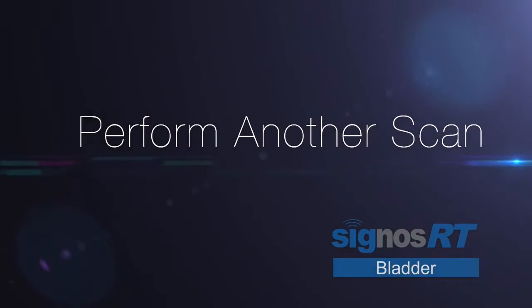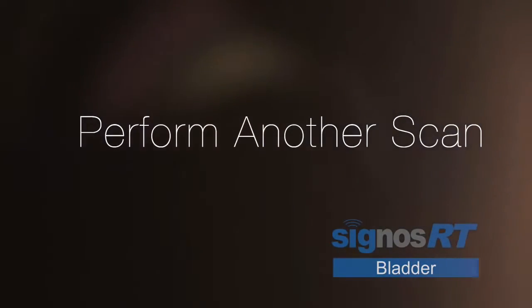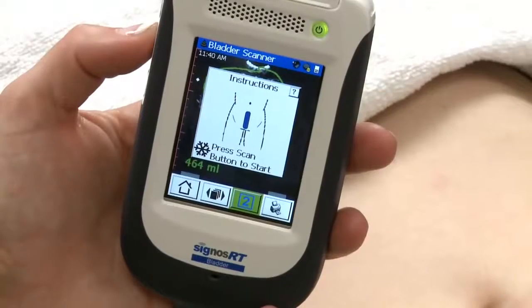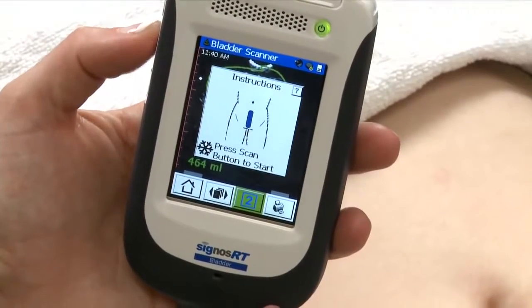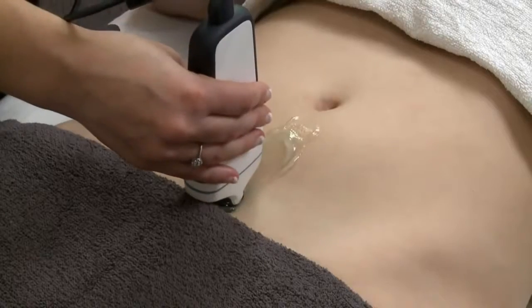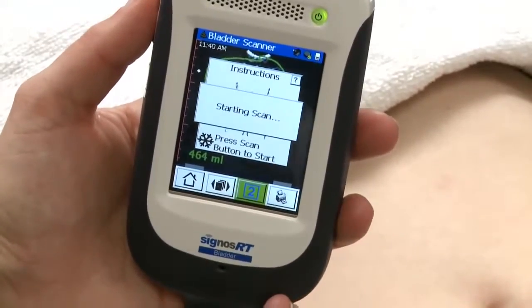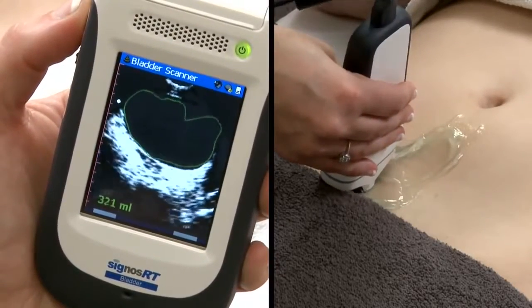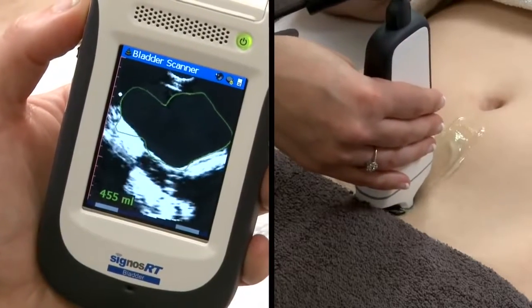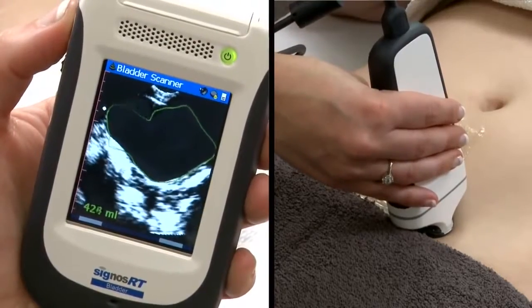If you wish to perform another scan at 90 degrees to the first scan for increased accuracy, select the number 2 icon. This will show the new probe orientation icon. Place the probe with the silver orientation dots towards the patient's head and begin scanning. Scan from right to left and obtain the largest measurement. The bladder scanner will calculate the bladder volume based on the last two scans you performed.